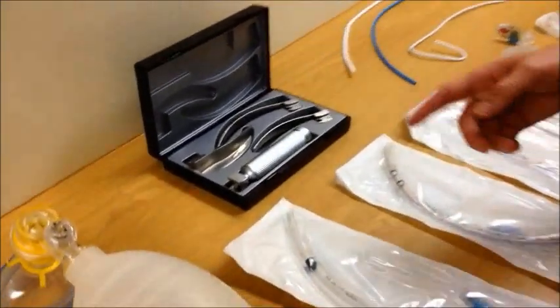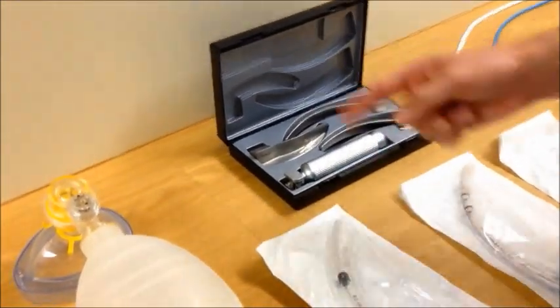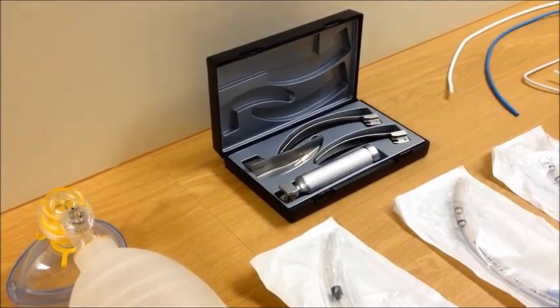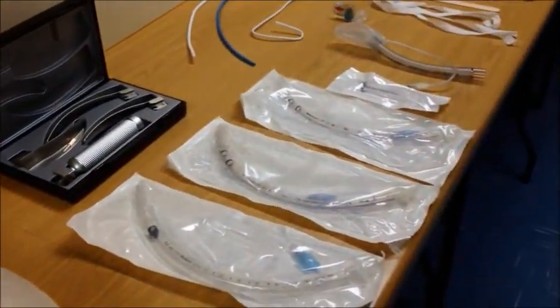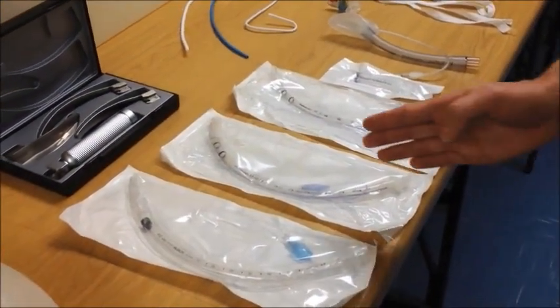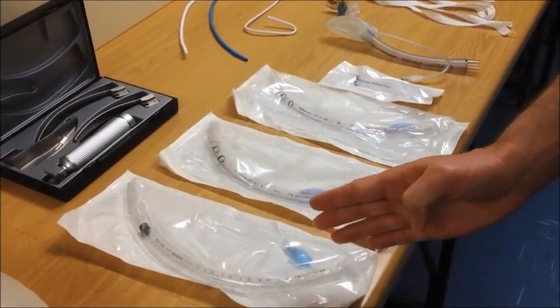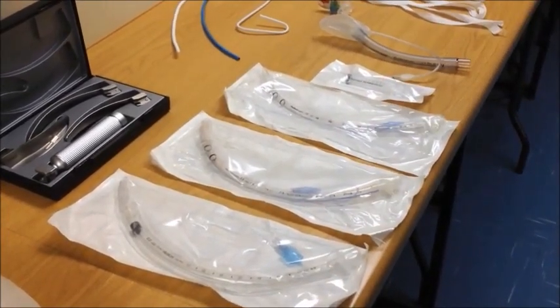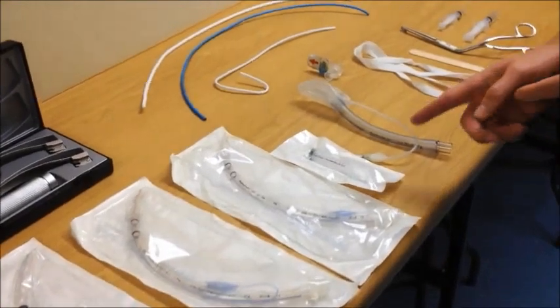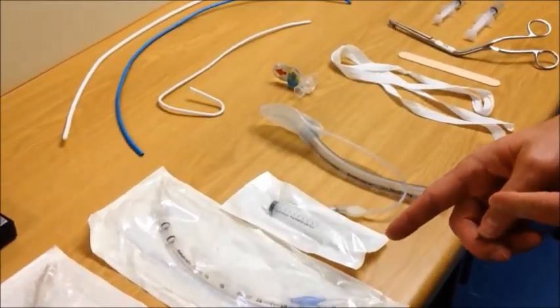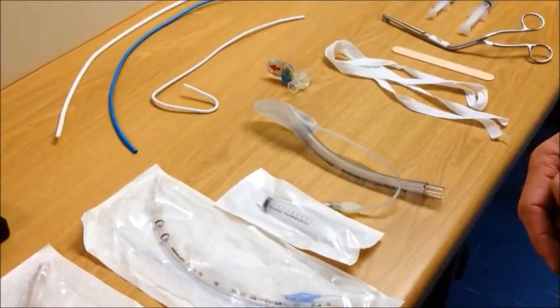You should have a laryngoscope with a selection of blades checked and in good working order and you should have a selection of sizes of endotracheal tubes. We suggest the size you're going to use and one size above and one size below in size. You should have a 10ml syringe to inflate the pilot cuff and the cuff of the ET tube.